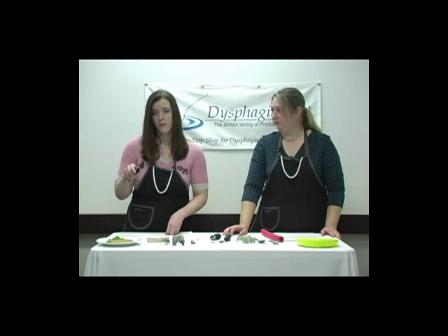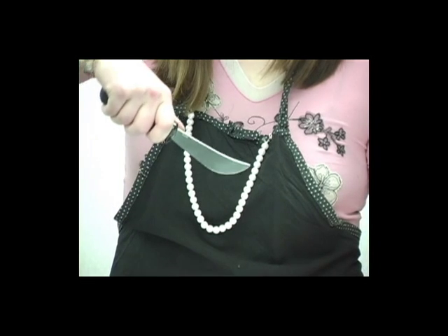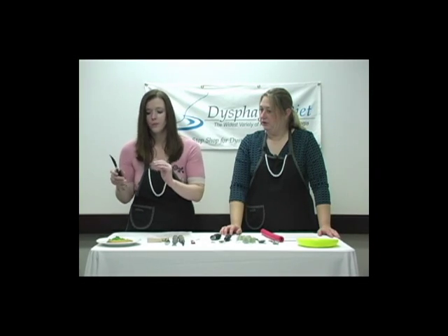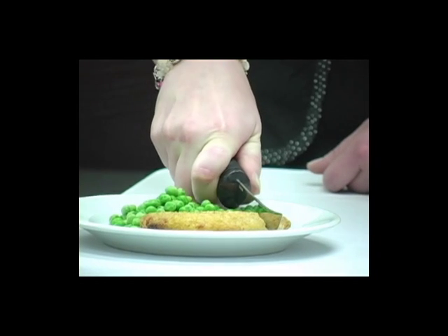And speaking of limited range of motion, this rocker knife is really handy. It's going to let you cut things using a rocking motion as opposed to the regular sawing action that you would do with a regular knife. So with this, you can cut things very easily, such as meats and other food items.